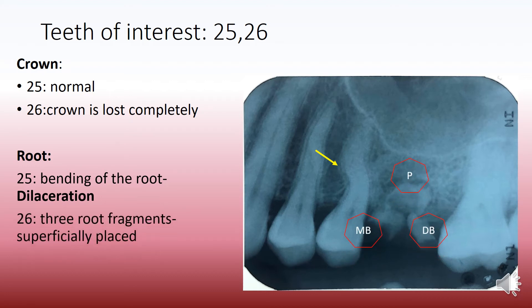In case of 2-6 we see that there are three root fragments. All maxillary first molars have three roots and we can distinctly differentiate the mesiobuccal from the distobuccal and the palatal root. The palatal root is relatively embedded in the bone whereas the mesiobuccal and the distobuccal roots are superficially placed.